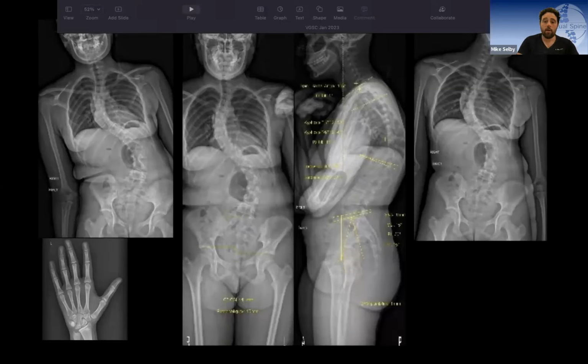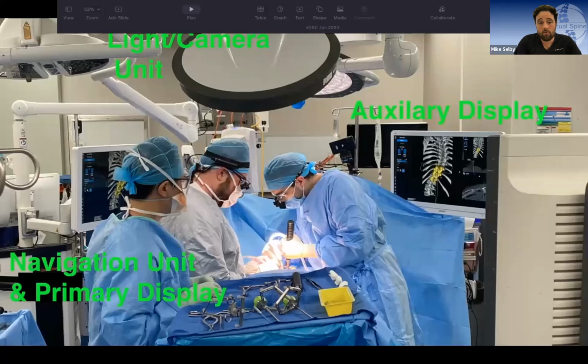So it's not adolescent idiopathic scoliosis, but adolescent spine curvature or deformity. And she's Sanders 4, so she's still got a lot of growth left. And this is not really a braceable curve. With the current magnitude, her EOS side benders, probably a little suboptimal in terms of effort, little flexibility in the lumbar, not much in the thoracic. Her lying imaging showed some flexibility in that thoracic curve.